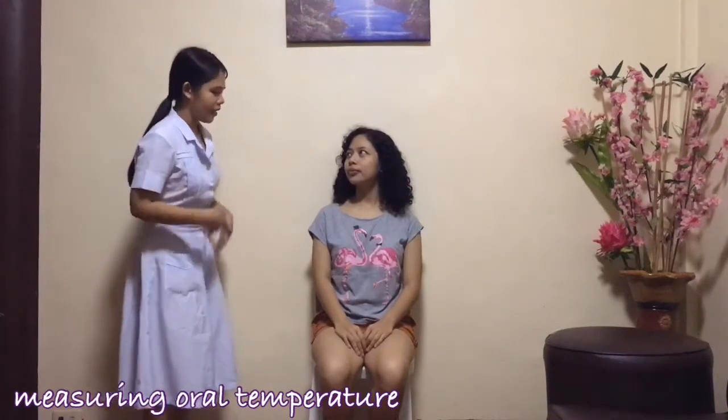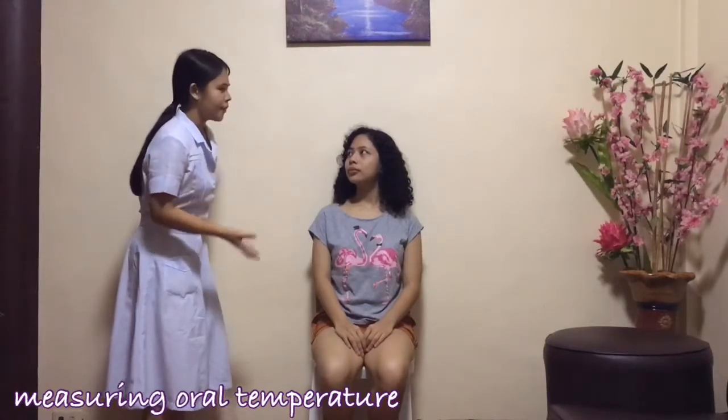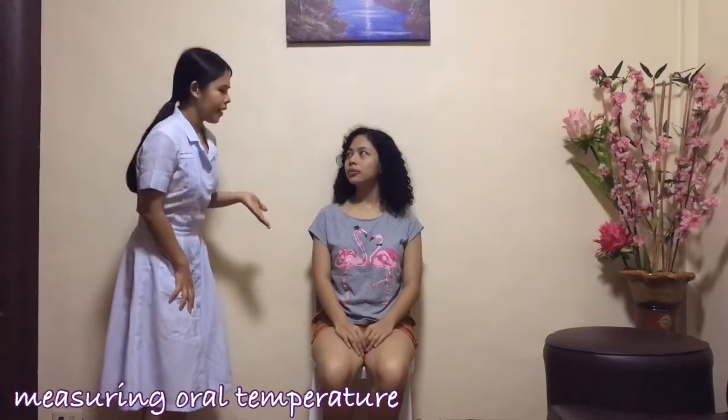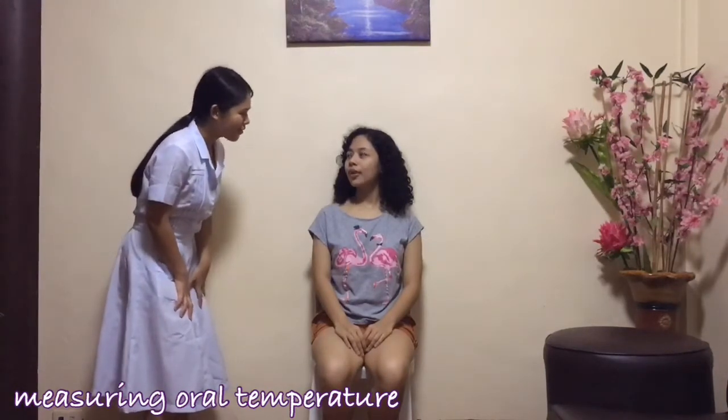Chandra, today I will be taking your vital signs, specifically your temperature. You just need to sit there comfortably and follow just a little bit of my instructions. Is that okay with you? Yes.